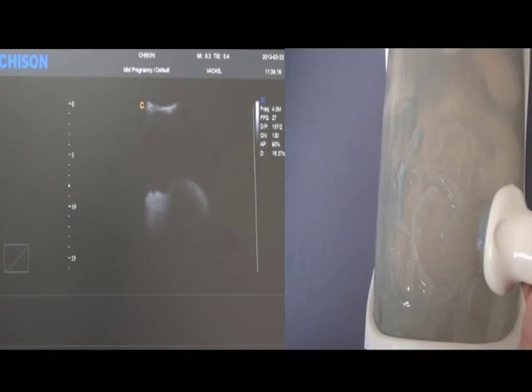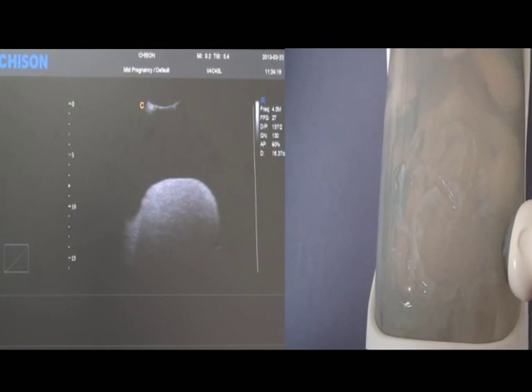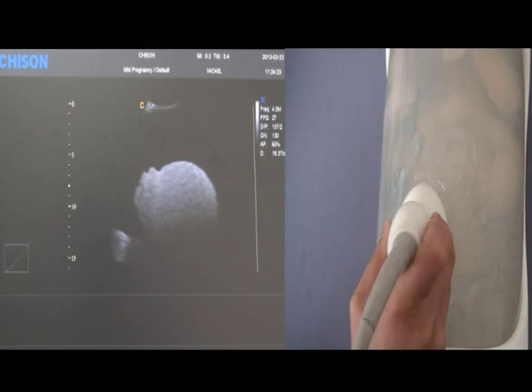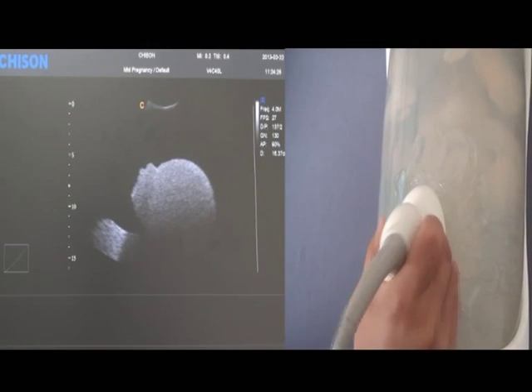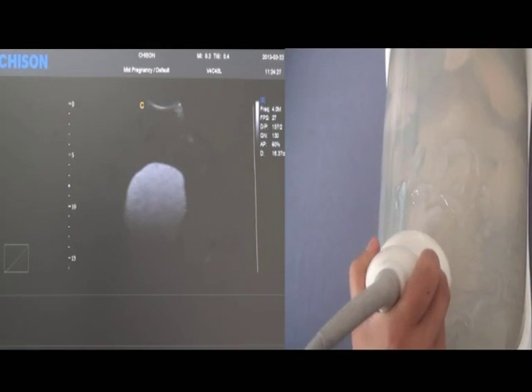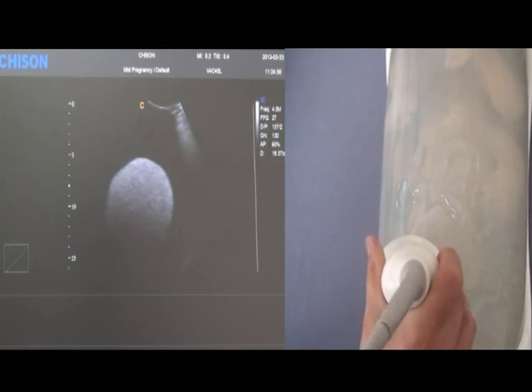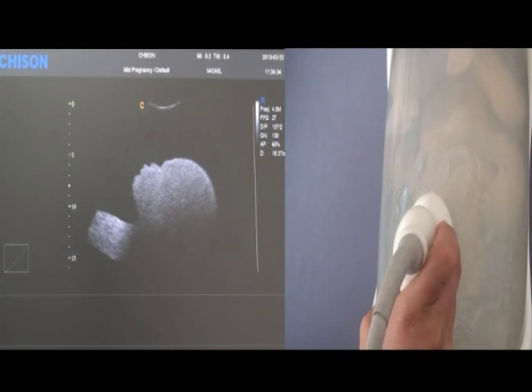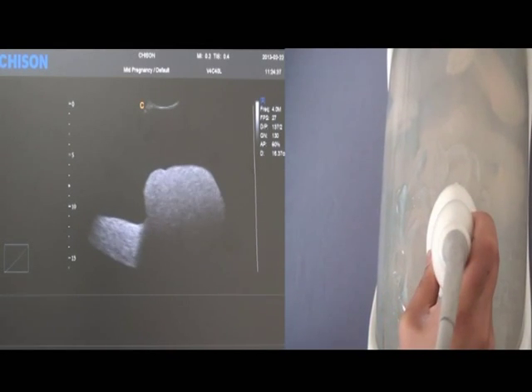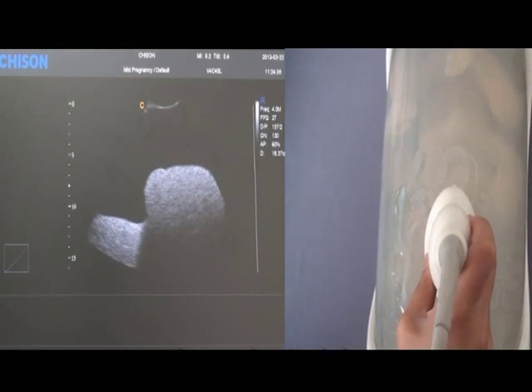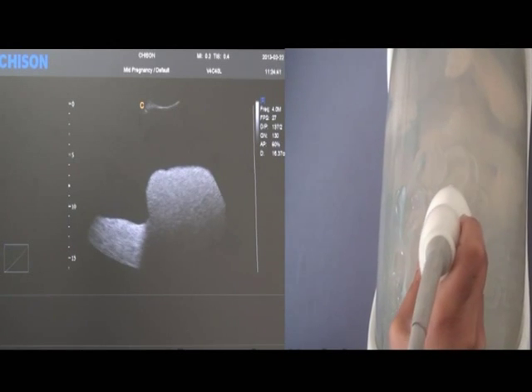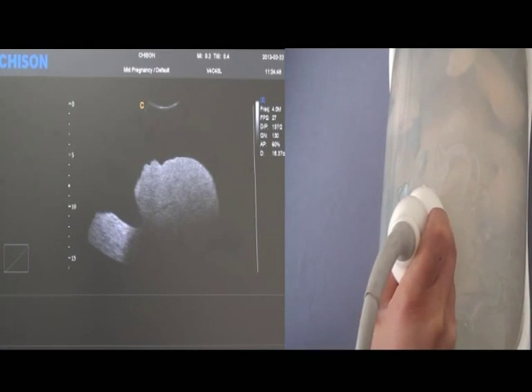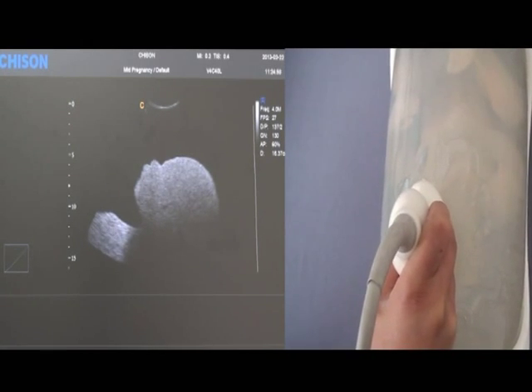But if you are in the coronal plane like this image, you need to move the probe like this to find the sagittal plane. If you are in the X plane like this image, you need to rotate the probe like this to get the sagittal plane. If you are not in the standard sagittal plane, just adjust your probe position slowly to get the standard one. When you get the standard sagittal plane, the 2D image preparation work is ready.